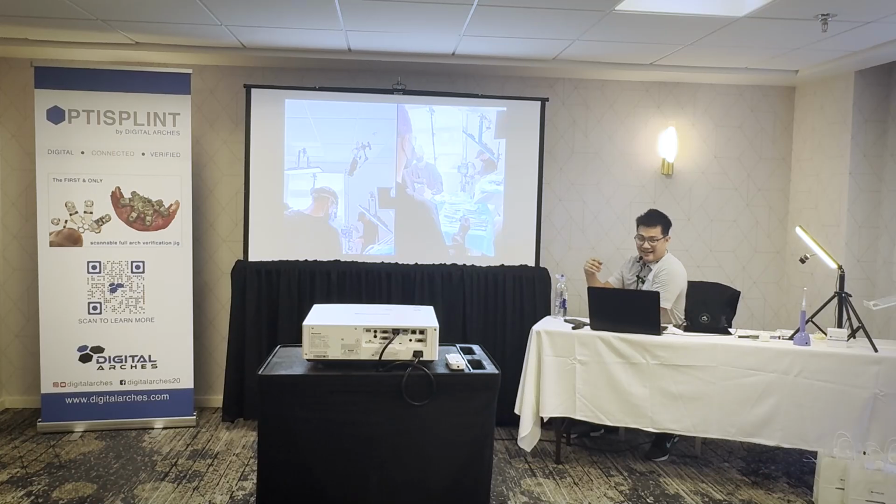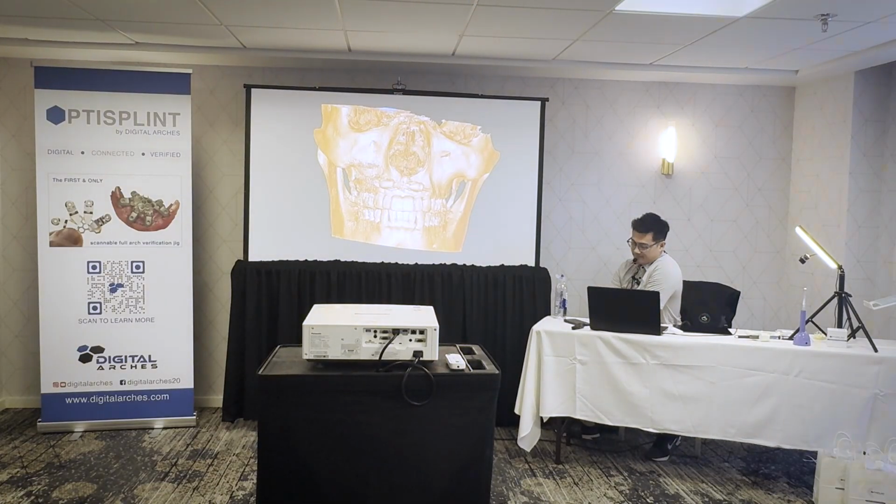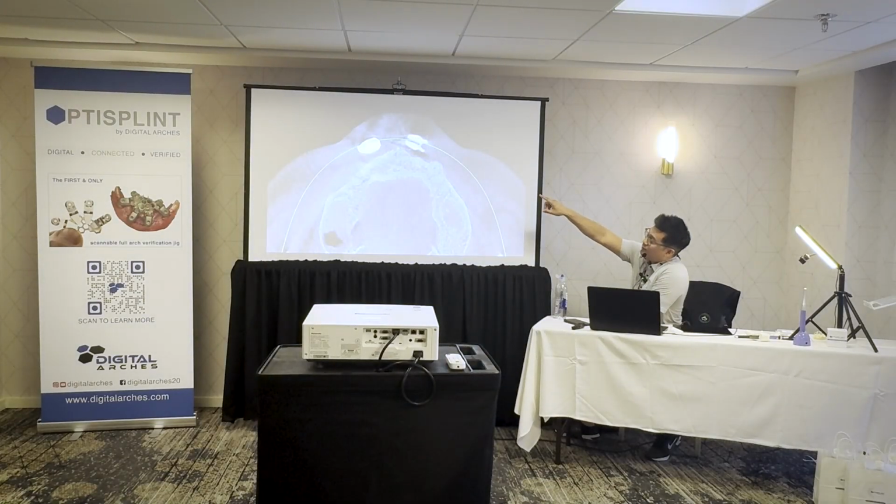So while they're doing this, I sneak in the back and I take my 2 radiopaque healing caps and put them into my vestibule, and I CT scan myself, to figure out which one's going to look better. And what I found was that the printed one, which is the one on the right, had less scatter. It came out cleaner. So I was like, okay, I'm going to try this today.